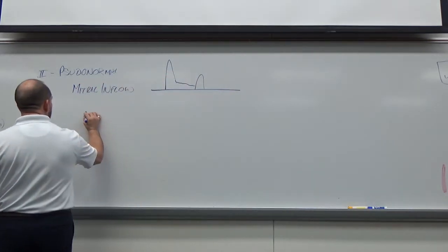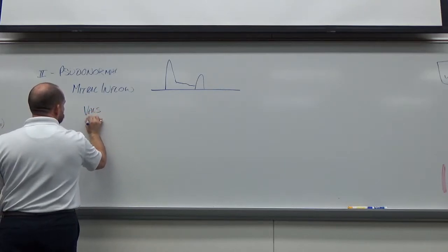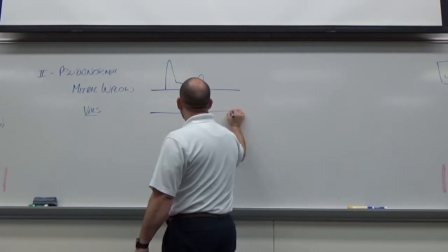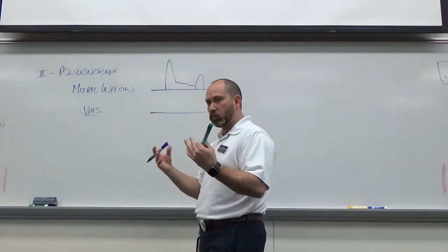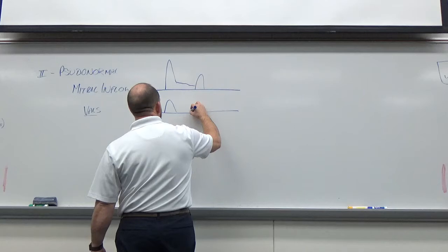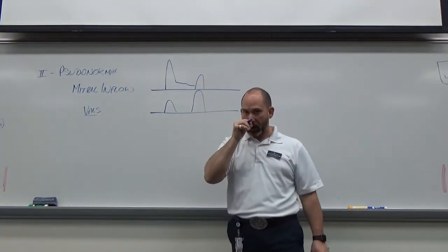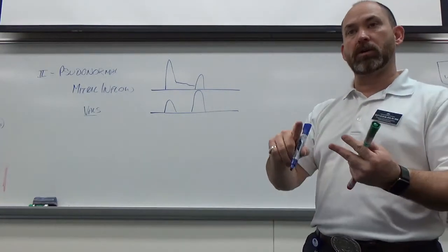What about Valsalva? This is where Valsalva does make a difference. So we do Valsalva. What do we expect to see with that? Not super small necessarily, but it reverses. It changes that relationship. So my E wave is now smaller than my A wave. I thought it just made it smaller. In the first two, on normal, it will make it smaller.